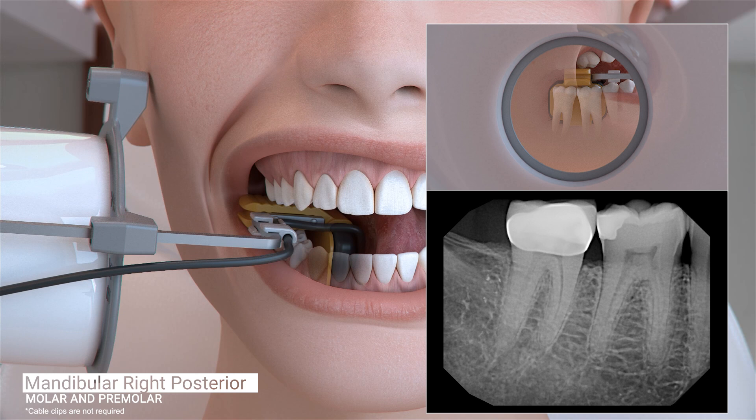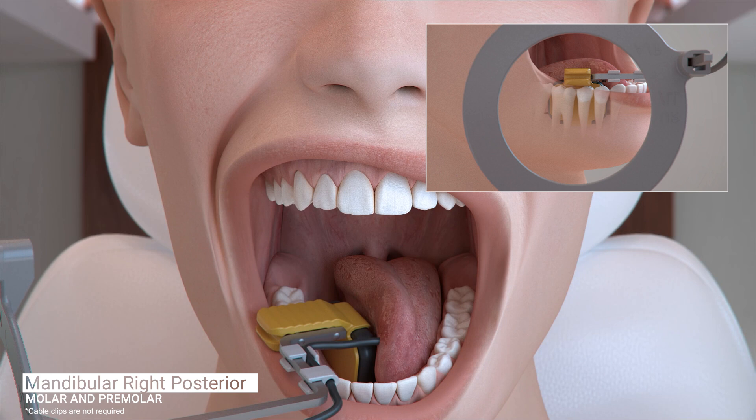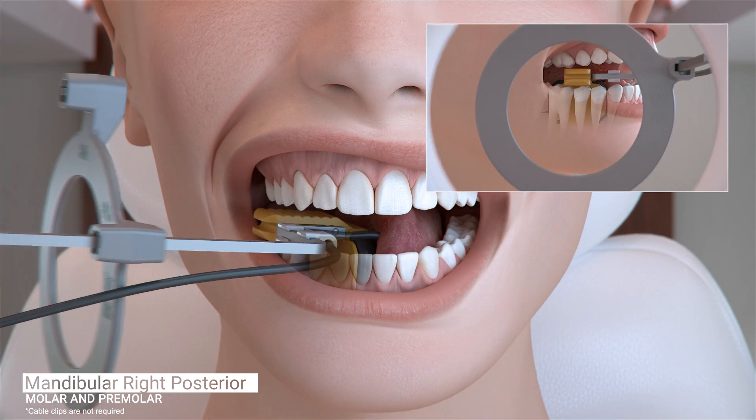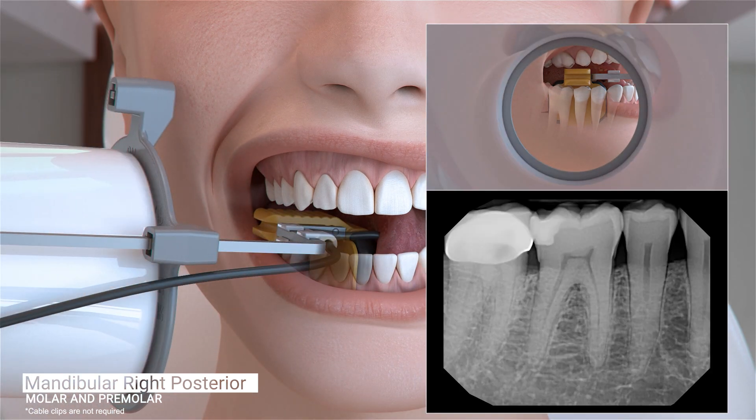Ask the patient to open slightly and gently slide the sensor forward, centering the first and second premolars on the sensor. Slide the aiming ring as close to the patient's jaw as possible. Position the cone of the X-ray emitter and trigger your exposure. The image should contain the distal of the canine through the mesial of the second molar.